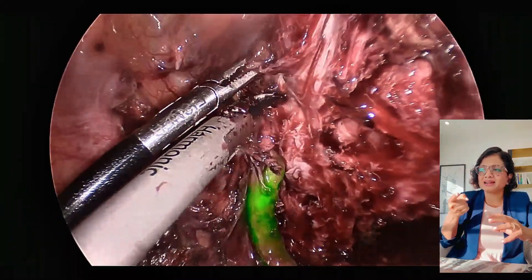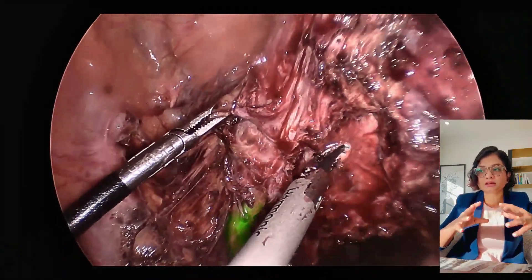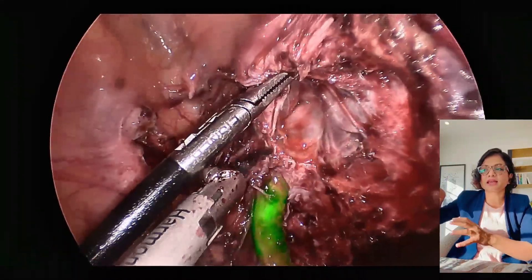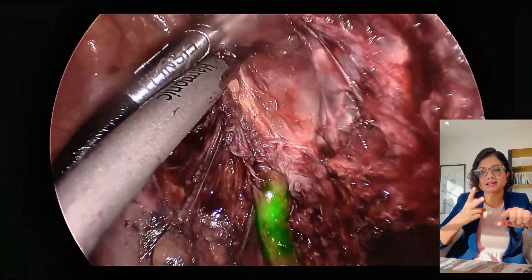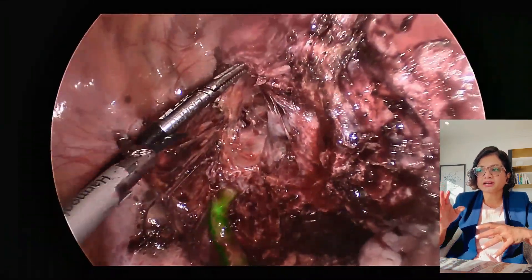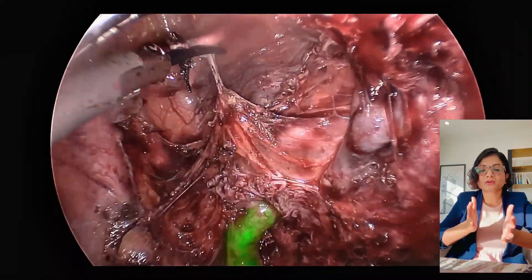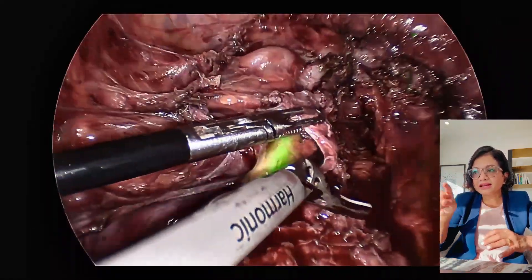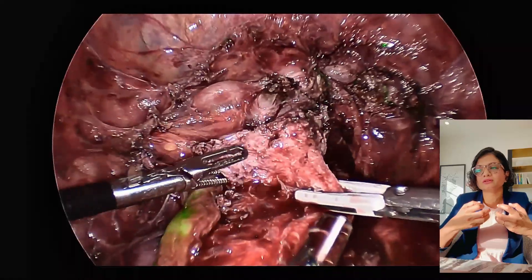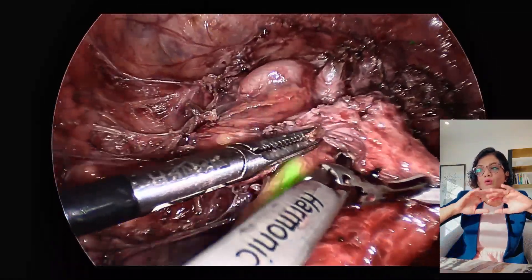I'm trying to make that cut and see if I can free it up, but again no respite. So I'm going to go a bit higher, pin down this nodule, thin it down, lift up as much as I can above and push it onto the uterus so I can take all of that in total when I do the hysterectomy, then come back to the ureteric tunnel and try to free up the roof. This helps with taking down my uterine artery as well — it's a bit higher up, but doing this increases the distance between the ureter and the uterine artery. That's why we lateralize — you really want to increase that distance.